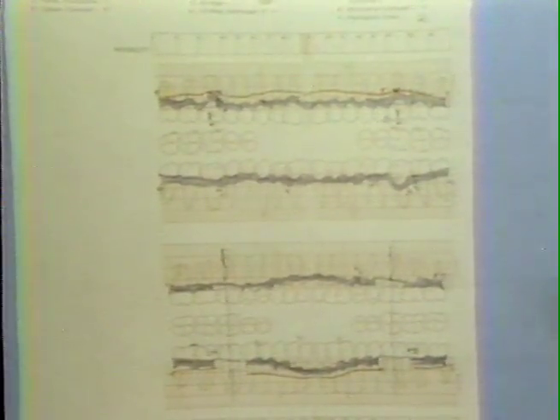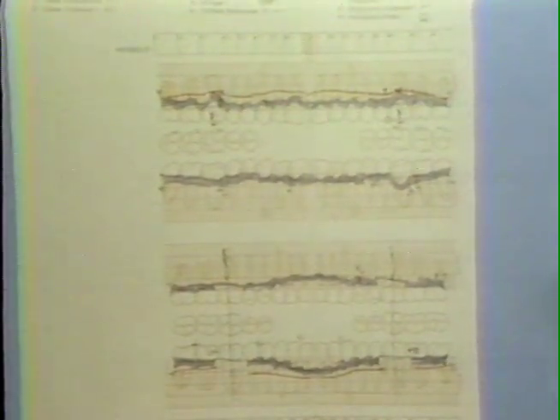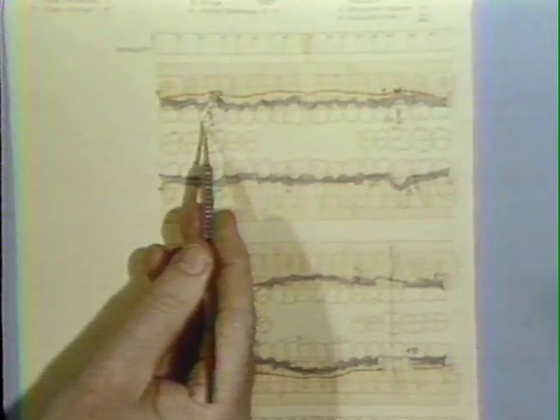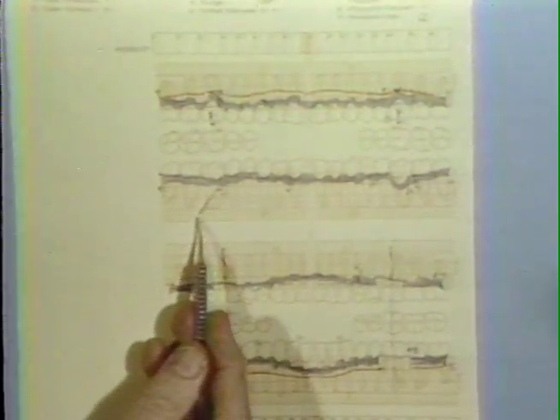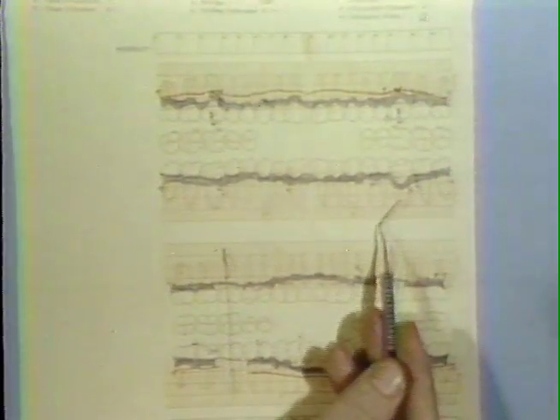Upon completion of the hygienic phase, the pockets are recharted to determine if there is any need for surgical elimination of residual pockets. Notice that there are only a few pockets deeper than 3 millimeters.